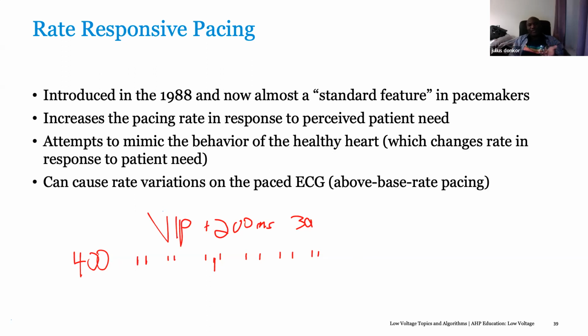If you're talking about managed ventricular pacing, AAI to DDD will do exactly what MVP does. But MVP is not on Sphera.